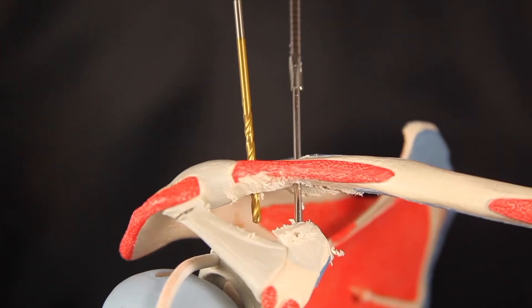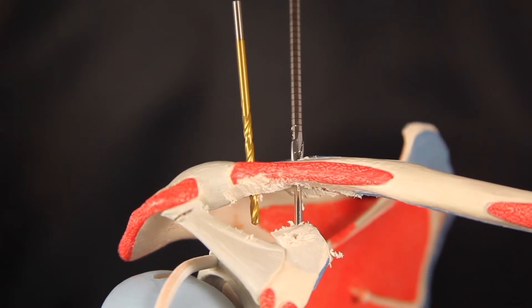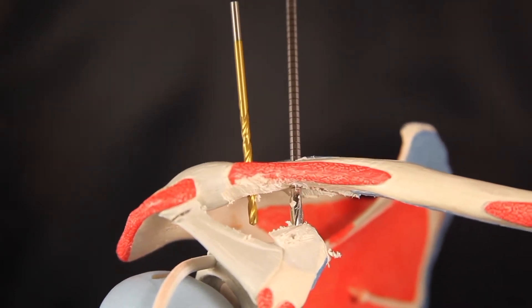A 4.5 millimeter endobutton drill is then used to ream the initial drill hole all the way through the base of the coracoid.